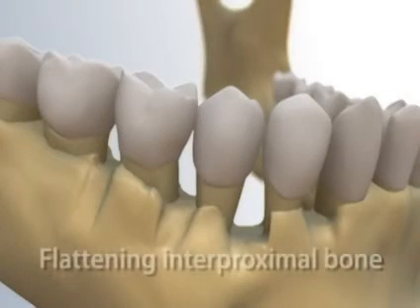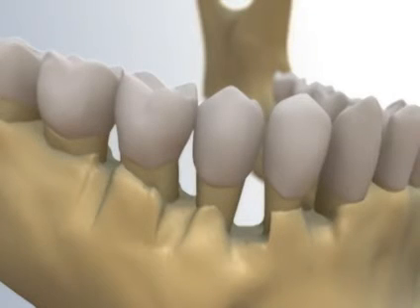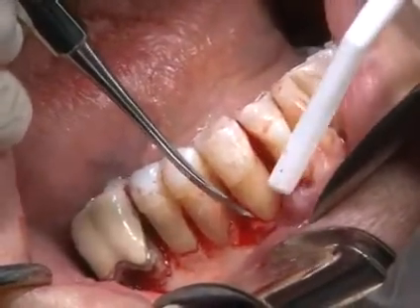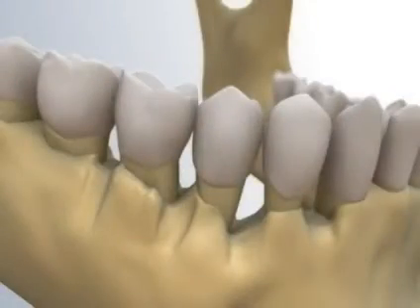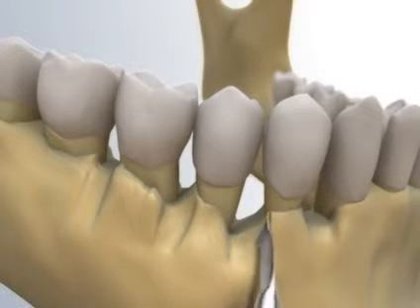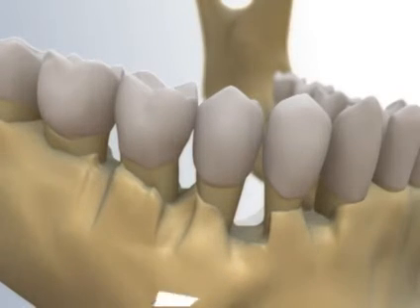The third step is flattening of the interproximal bone. This step is indicated when interproximal bone levels vary horizontally, requiring some degree of ostectomy. Ostectomy is the removal of supporting alveolar bone. Because the interproximal bone on tooth 4-4 distal is more coronal than the bone level on tooth 4-5, ostectomy will have to be performed to flatten the interproximal bone. Some of the supporting bone on tooth 4-4 distal is removed with small hand chisels.